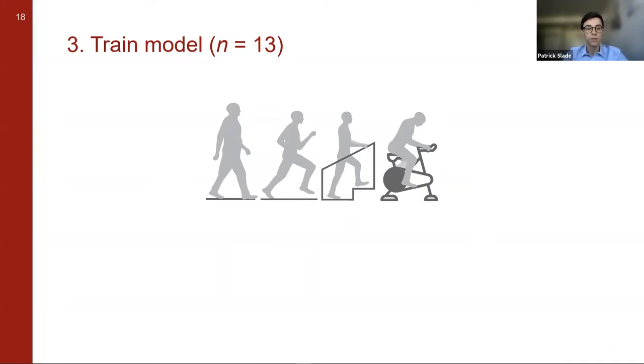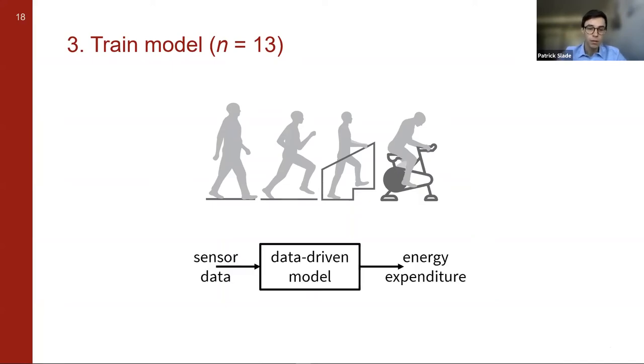So once we collected all this training data, we did the same procedure as we talked about before. We passed the sensor data into the data-driven model to get our fit model, which we can use to estimate energy expenditure.